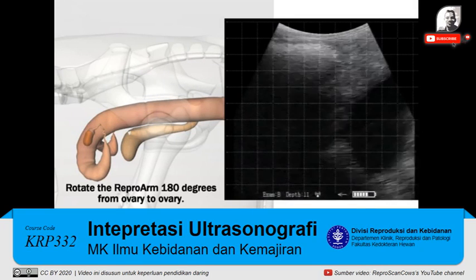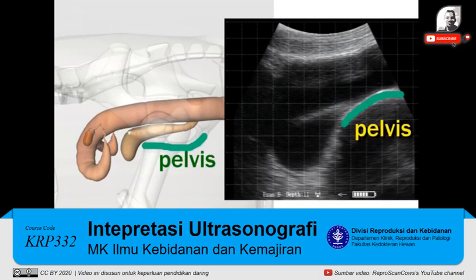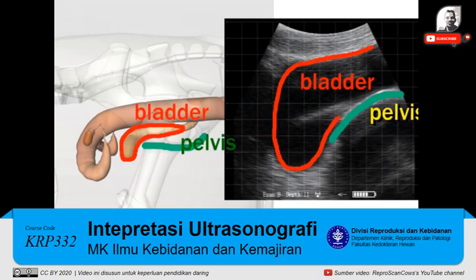Now it's rotated 180 degrees ovary to ovary. Here we're marking out some landmarks: the pelvis in green and the bladder in red.